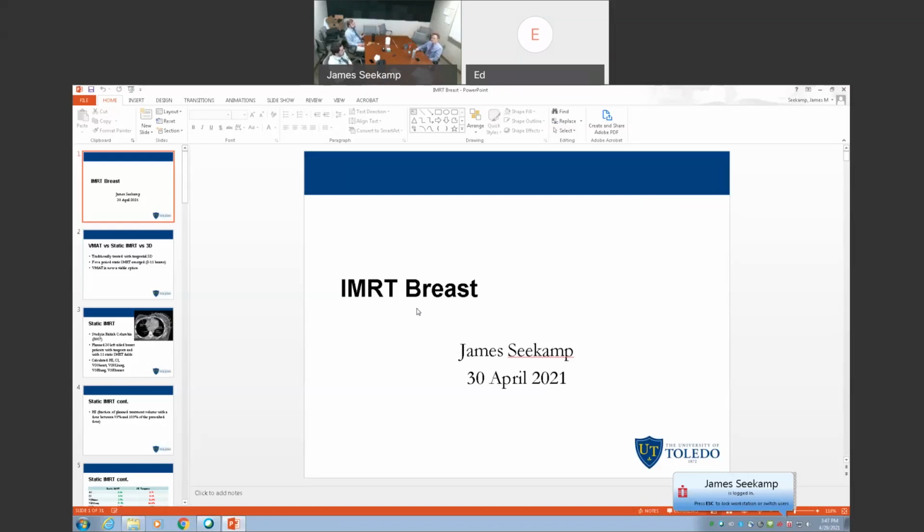Now, maybe you could get to the point where you don't need to prove it because you're using robustness and you're trusting the robustness, and you've looked at a bunch of previous patients and cone beam CTs for every patient, and you know that in no circumstances is it ever going to be worse than this distance.